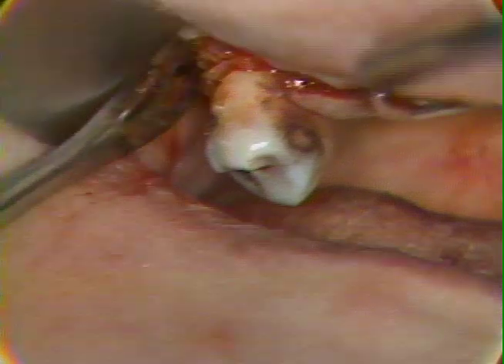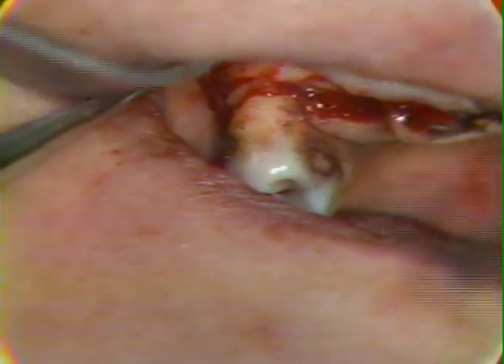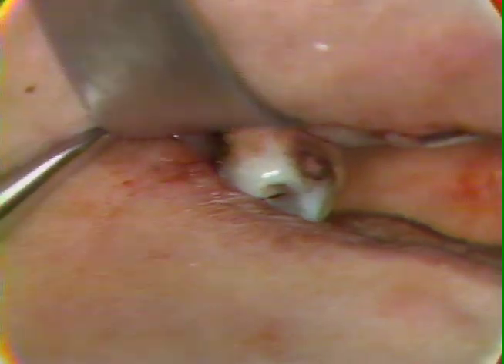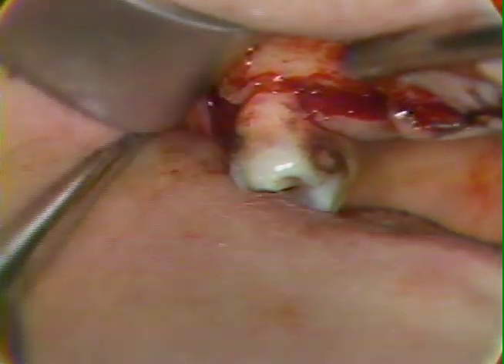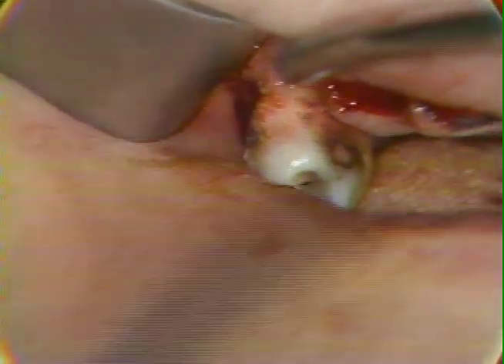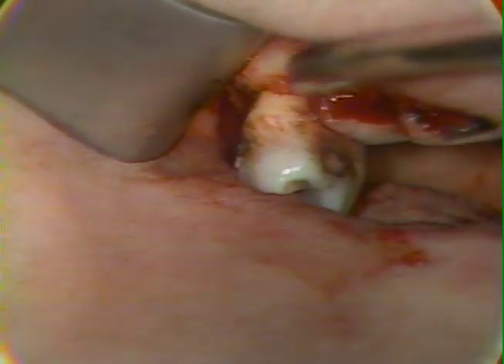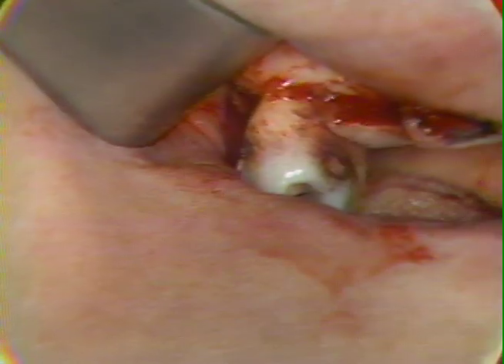After I have this flap lifted, I'll try to engage it with the tip of this retractor, and you may see just a little bit more of our immediate field. I think if we get that little remnant of soft tissue out of the bifurcation area, that will be fine. Now you can see the bifurcation zone exposed.